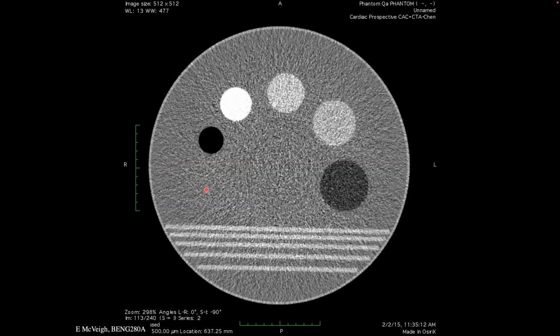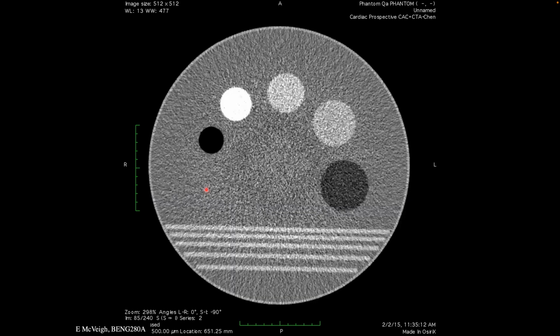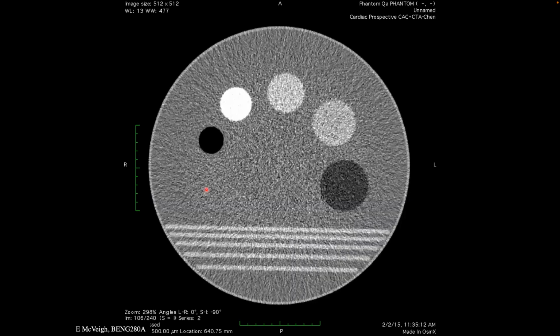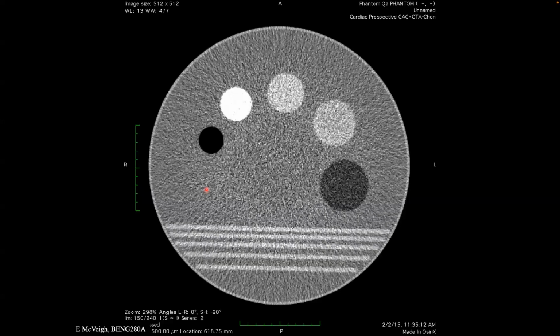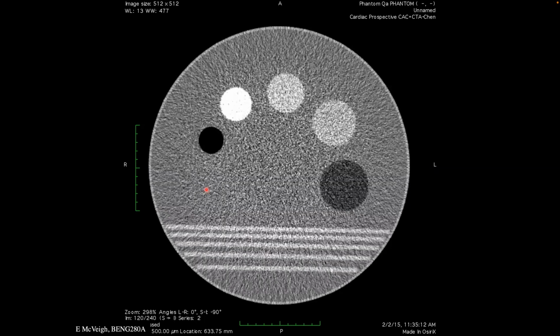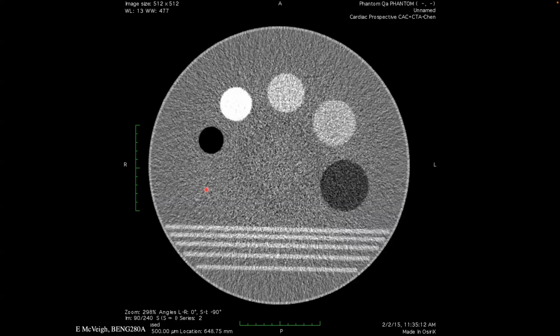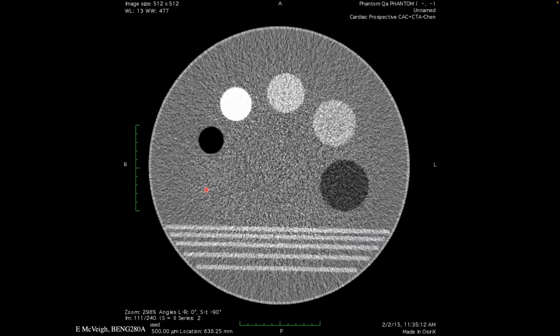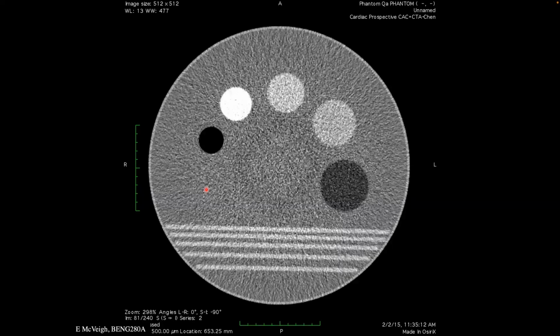So unless you get the summation of all of those back projections spot on, you're going to see artifacts from edges. What usually happens from an edge is it'll broadcast artifacts, called a streak, off to somewhere else in the field of view. Here, this is really fascinating because it does look really local and it does look like it's spinning.